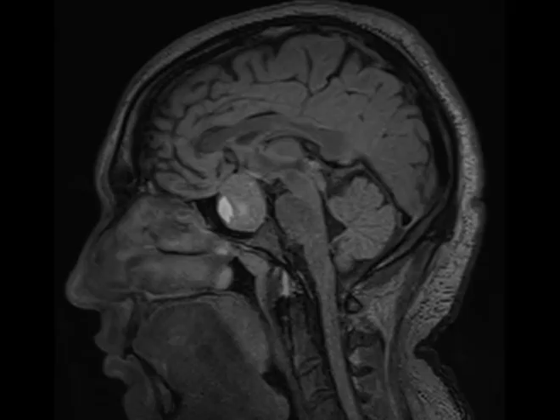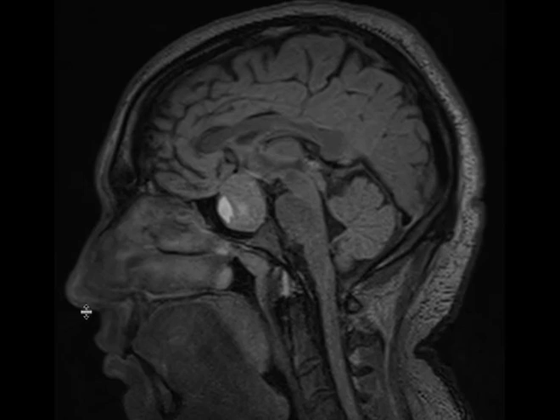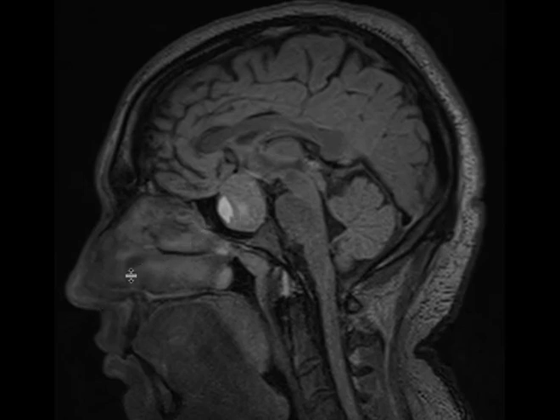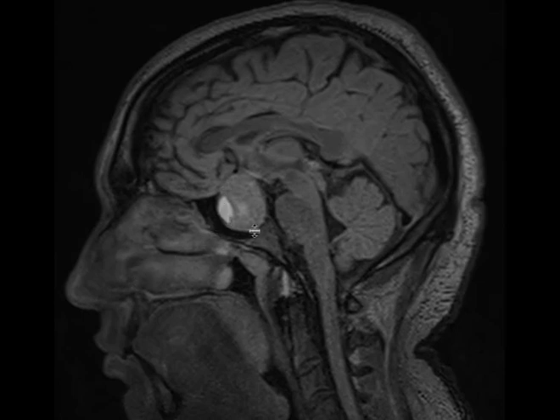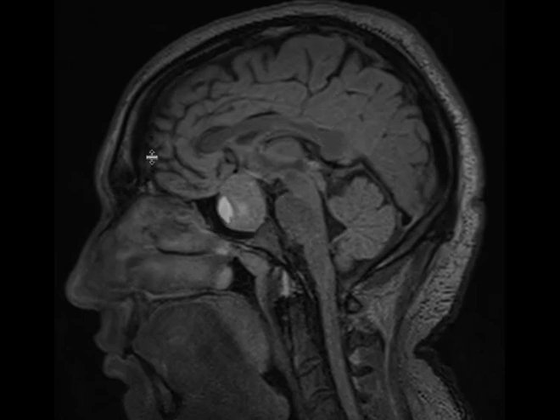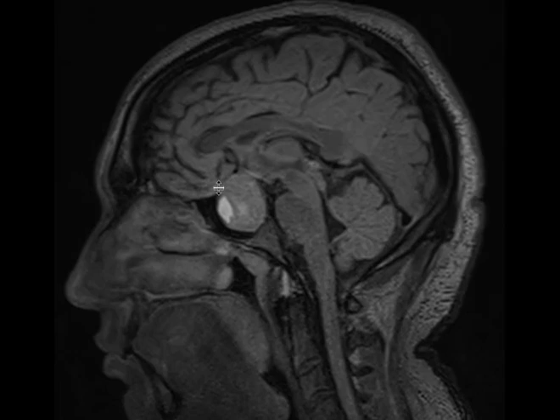In modern neurosurgery, the primary approach to remove the tumor is through the nose, and we can approach the tumor and remove it without having to open up the skull and retract the brain.